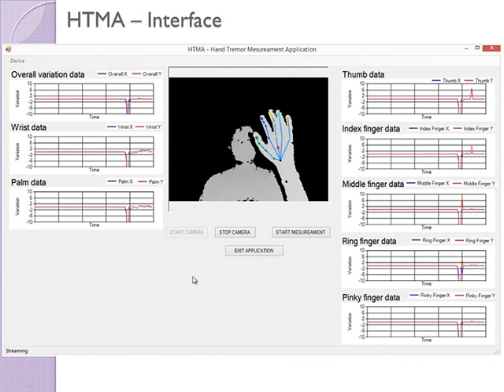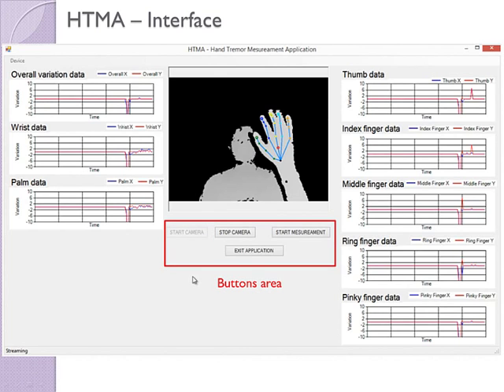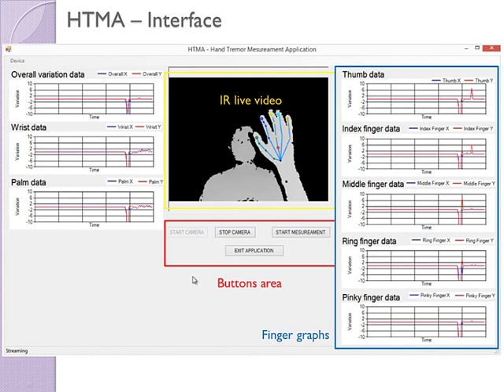The HTMA user interface is simple. In the bottom center we have buttons to start and stop the camera, exit the application and begin the 10-second measurement session. On the top center we show a live infrared camera video that tracks the hand, fingers, palm and wrist points. On the right side we have line graphs that show the X and Y coordinate variations over time.